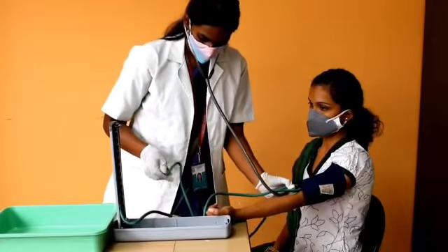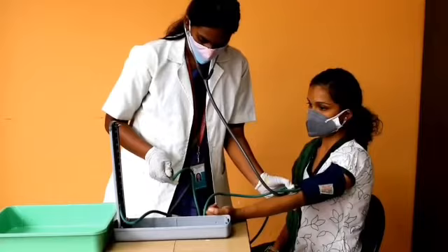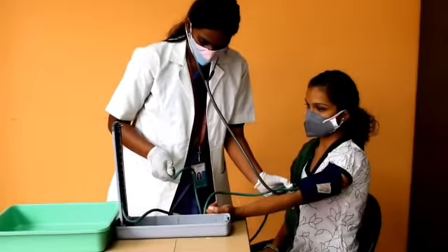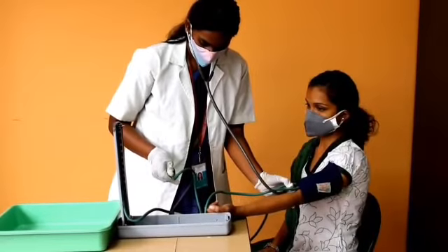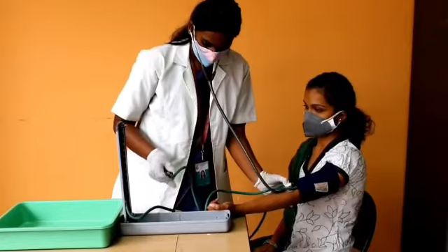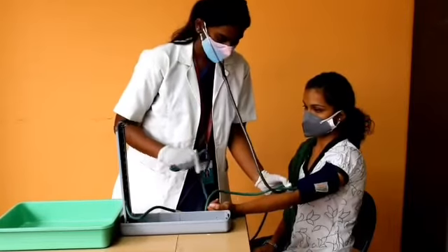Note the point on the dial when the first clear sound is heard — that is the systolic blood pressure. The sound will slowly increase in intensity. Continue deflating the cuff and note the point where the sound disappears — that is the diastolic pressure. Listen for 10 to 20 mmHg after the last sound.